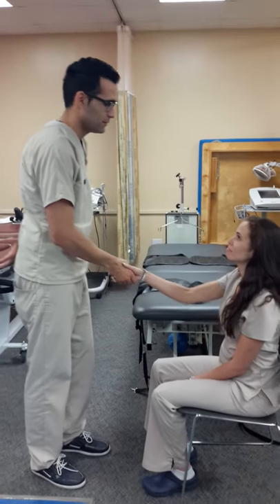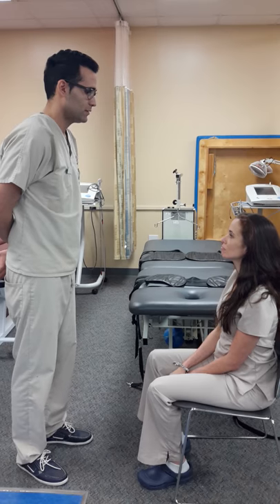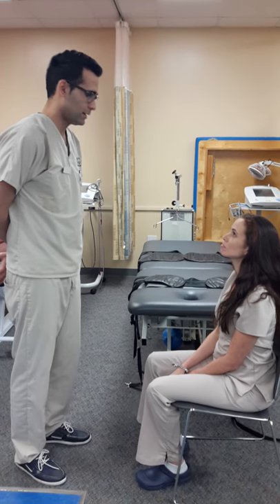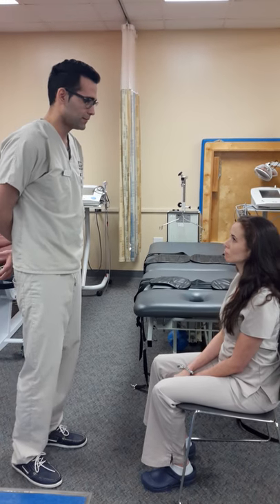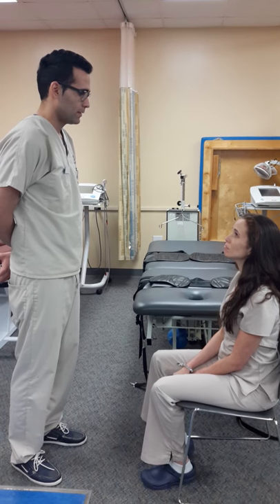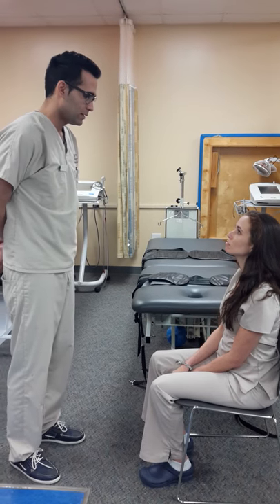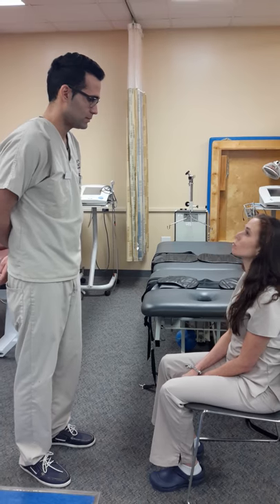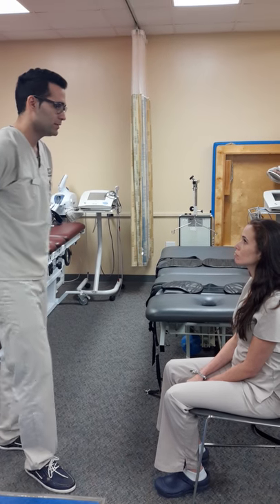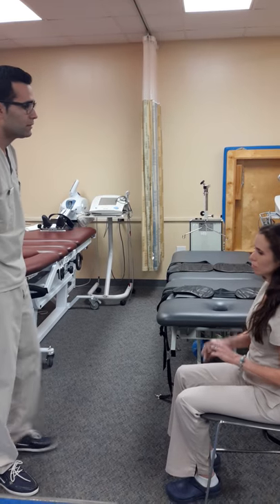Good afternoon, Mrs. Diaz. My name is Leona. I'm going to be a student physical therapist assistant for today. I read in your chart that you have a herniated disc. How are you? I have some pain. Today we're going to use a cervical traction machine that's going to help you with the pain and also with release pressure. So before we continue with the treatment, go ahead and pick up your hair and then take off the earrings for me.